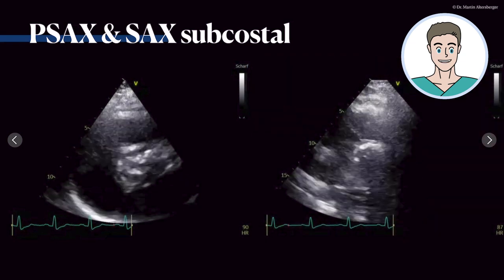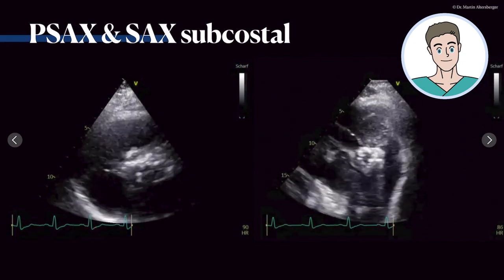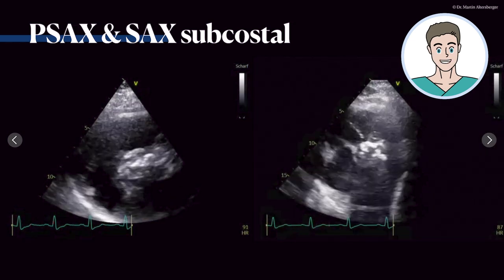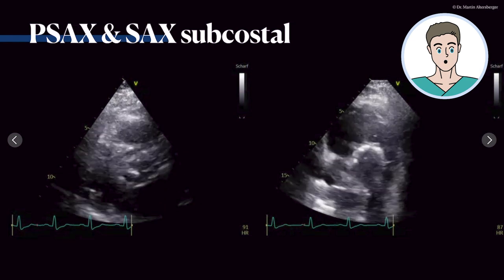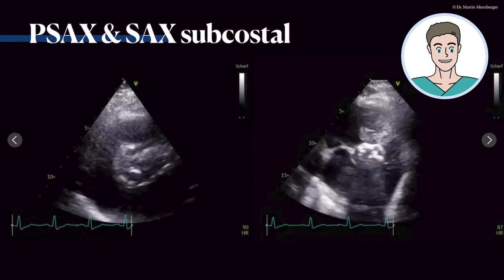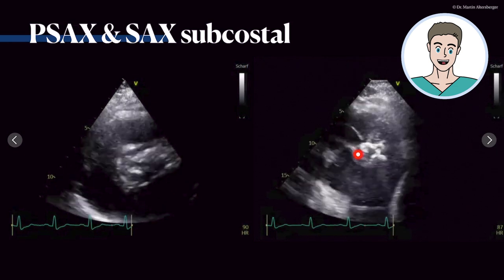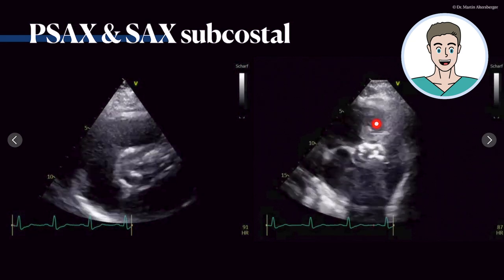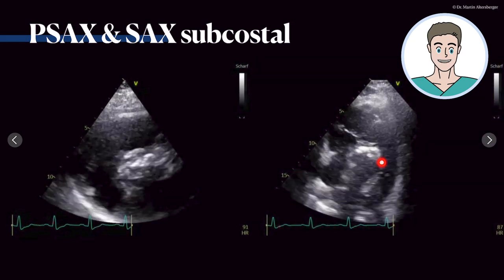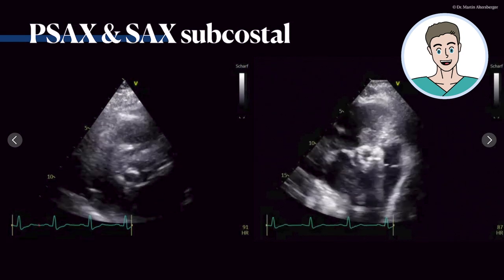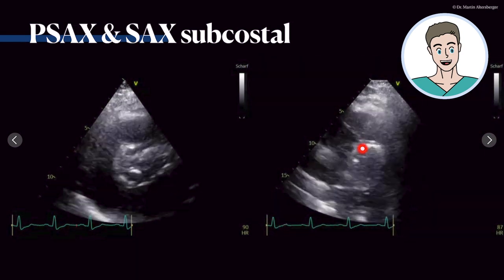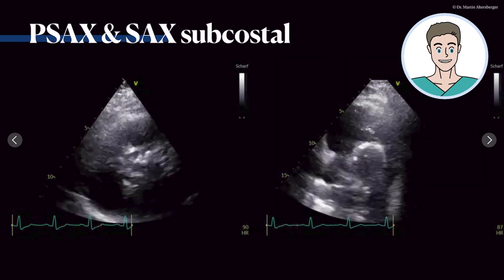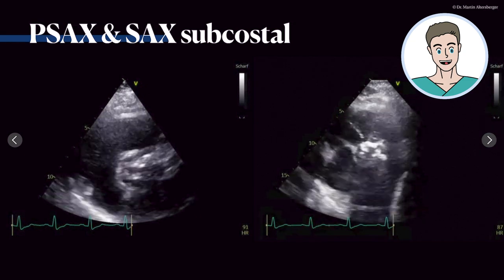This is a subcostal short axis. How do you achieve that view? When you have a four-chamber view where the marker points to the left side of the patient in the subcostal approach, you simply rotate the transducer and tilt it upwards, like you would in a parasternal approach to see the same structure. Here is the aortic valve, here is the interatrial septum, tricuspid valve, right ventricle RVOT. Here you can nicely see that the valve is severely calcified — even the calcifications block the field of view in the far field. This is truly a severely calcified aortic valve.